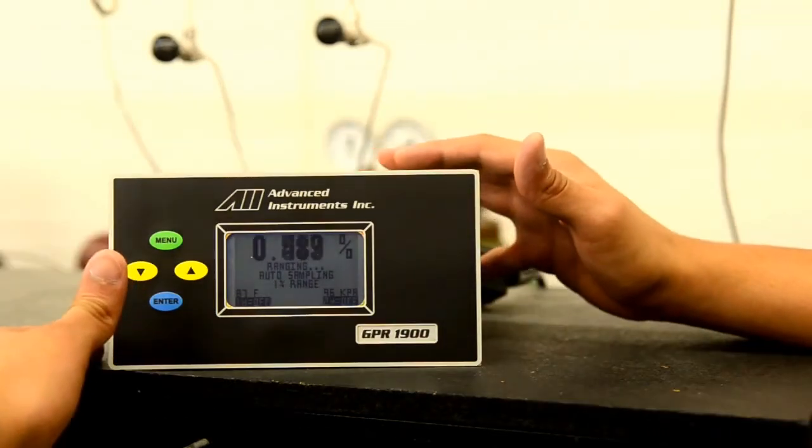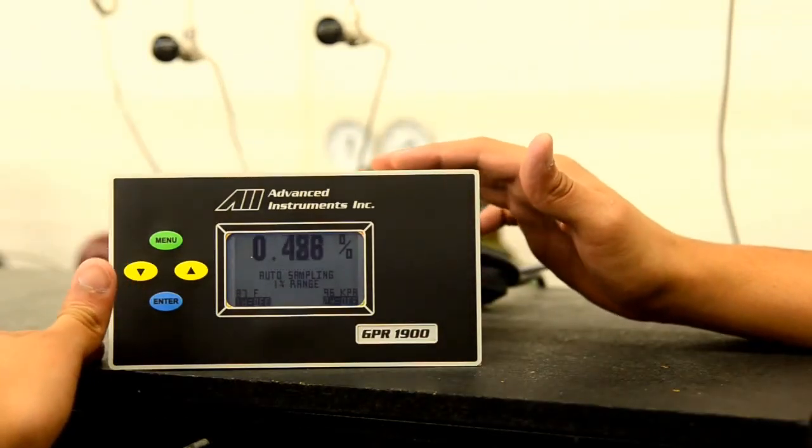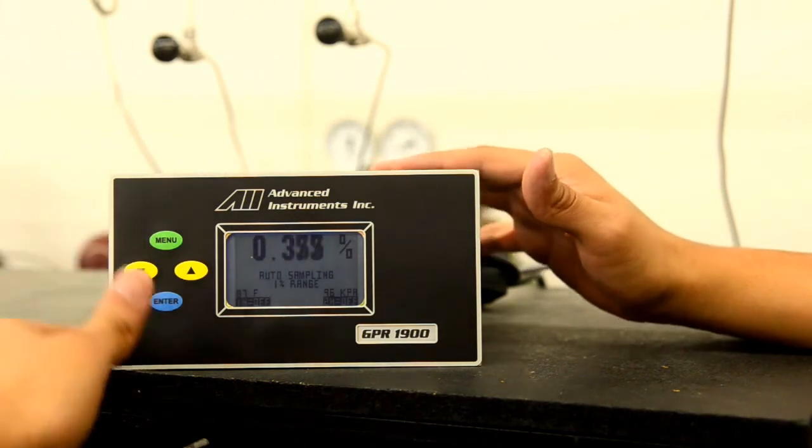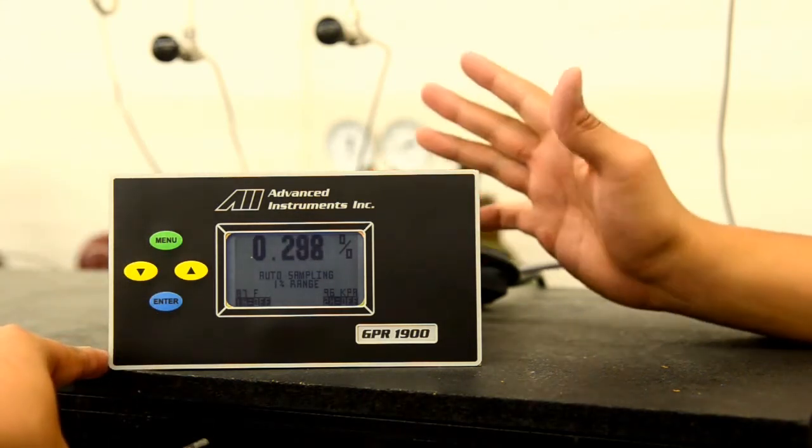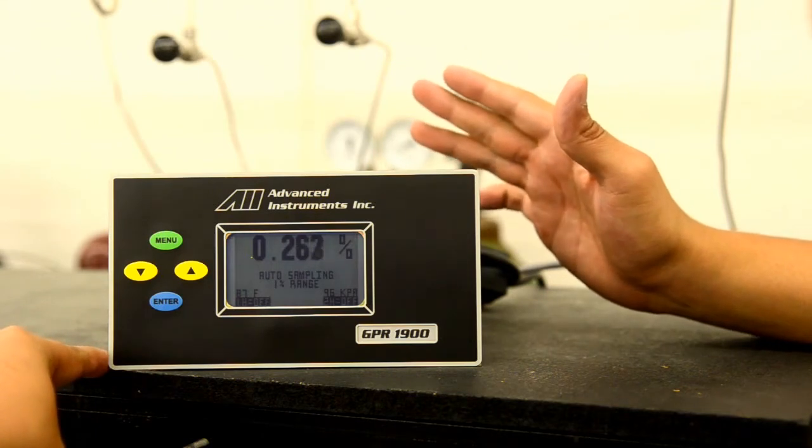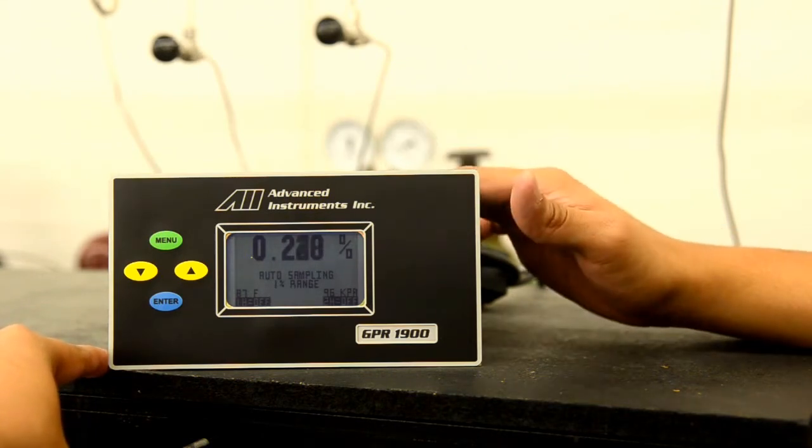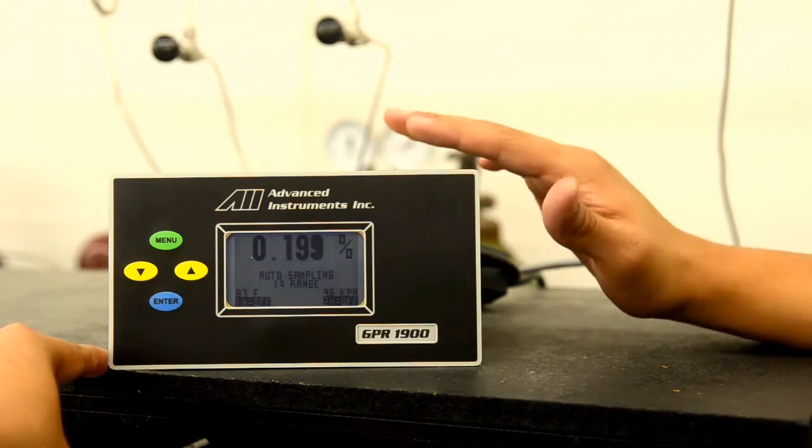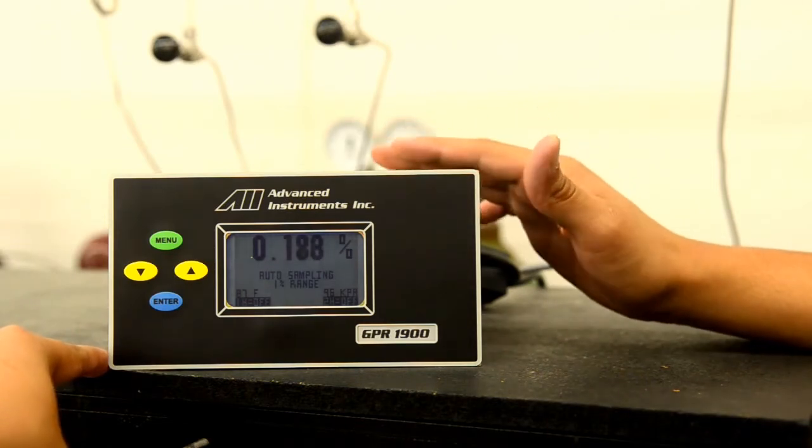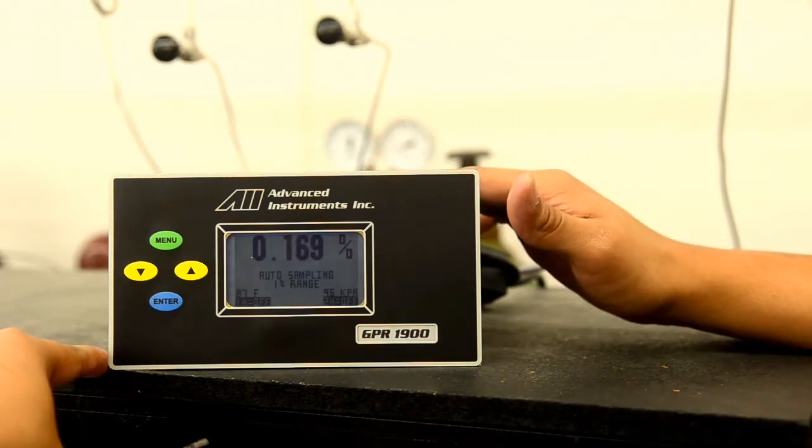As you can see, the sensor is responding to the zero gas and coming down relatively quickly. This process to come below 10 parts per million can take anywhere from 30 minutes to 1 hour, depending on the length of time the oxygen sensor has been exposed to ambient air, which we recommend a time no longer than 3 minutes, and also the quality of the gas along with the flow of the gas across the sensor head.